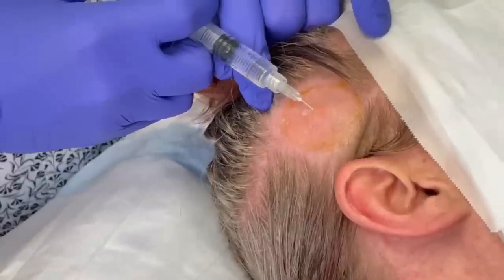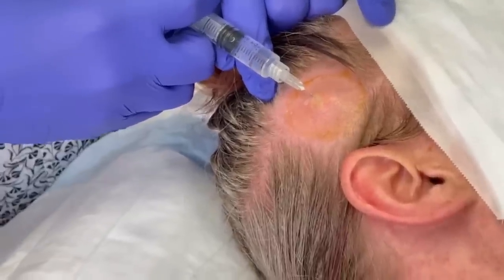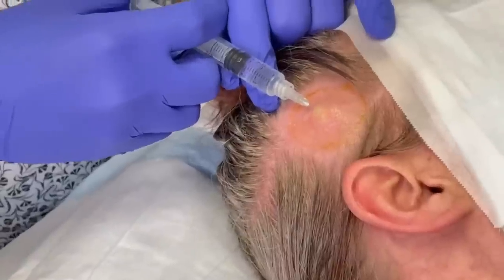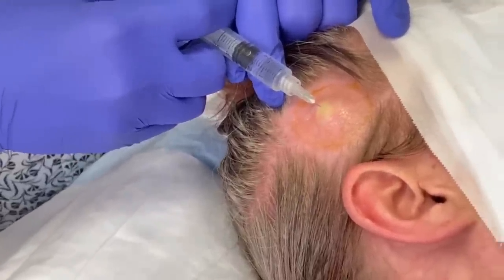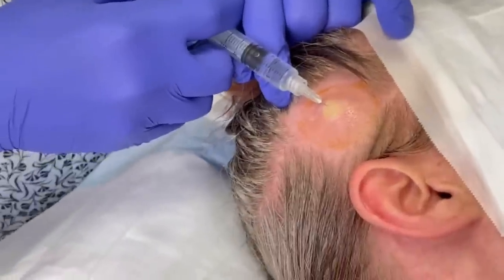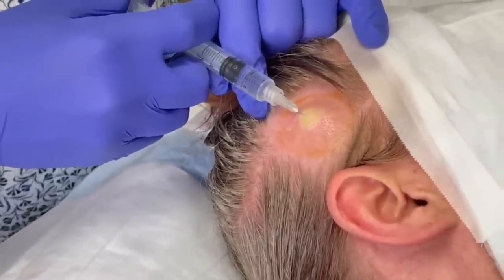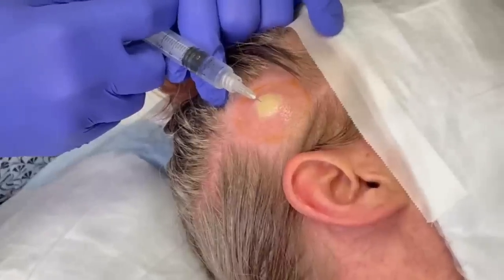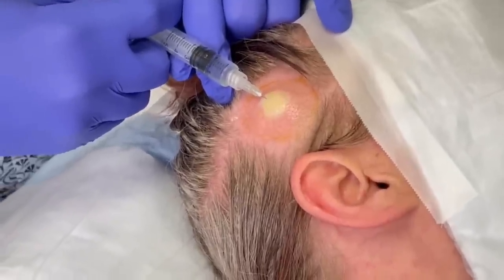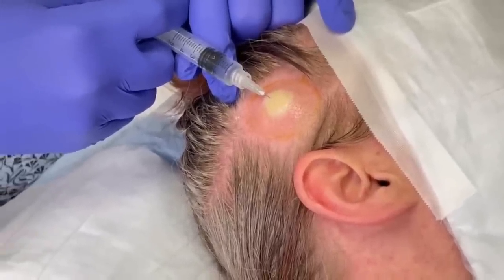And what are we administering? Lidocaine. You have some epinephrine here. So we're just going to slowly infiltrate the medicine here. Squeeze my hands. Changing colors. Something having to do with turgor pressure, I believe it was, Jenny. Isn't that right?